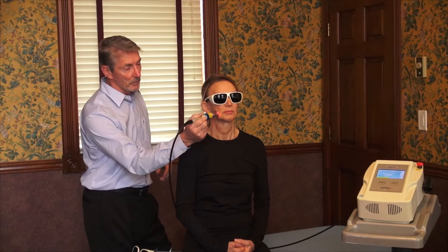For the degenerative disc, use a more focused aperture or stay longer with the narrower beam. In conditions of post-traumatic cases — where there are facial lesions associated with dental damage or oral cavity injury, post-surgical — I would treat not only the dental component but the facial area as well. That will accelerate lesion healing, contributing to the whole healing process.